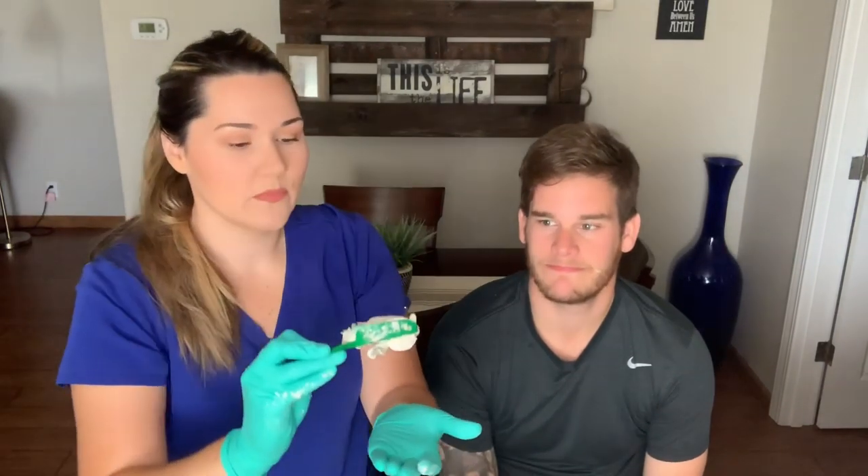The alginate did not go over the sides as you want, and lots of the impression tray is showing — he does have a rather large mouth. In office, if he was absolutely not doing it again, depending on what was being done — if it was partials or a denture, I'd definitely show the dentist. If it was a bleach tray or night guard, I might just pour this up and see how the model turned out. Most patients will let you retake it when something important like partials or dentures is involved.